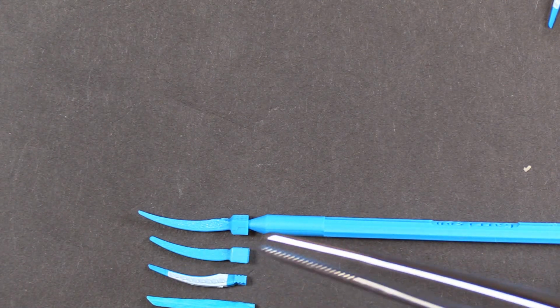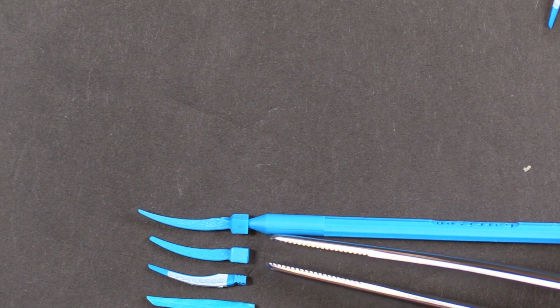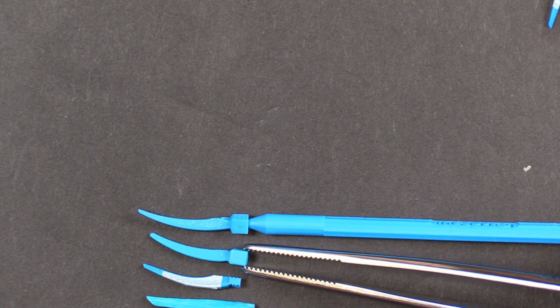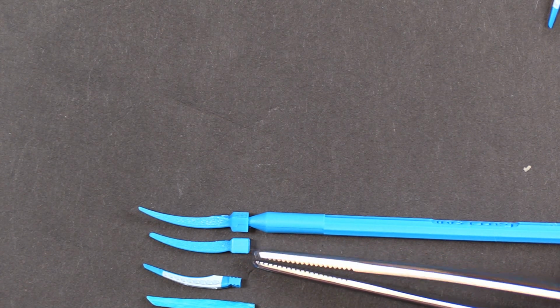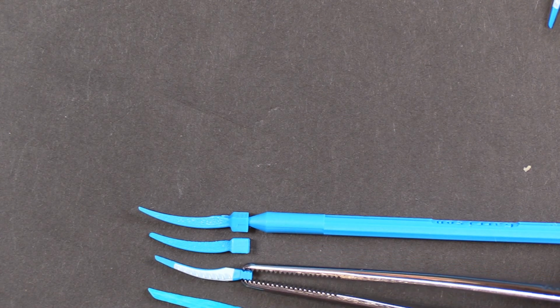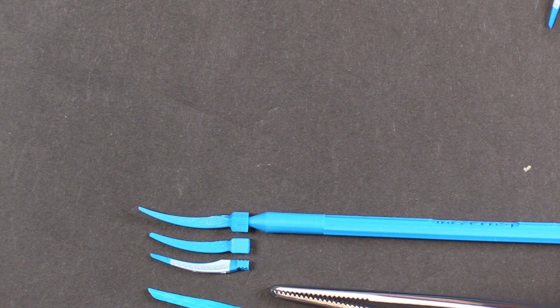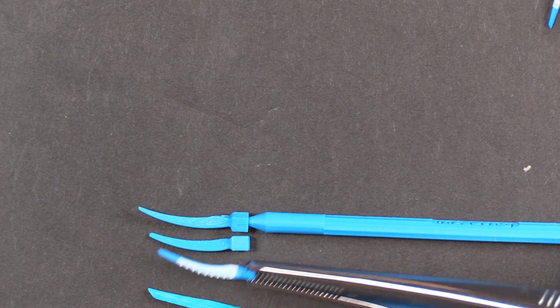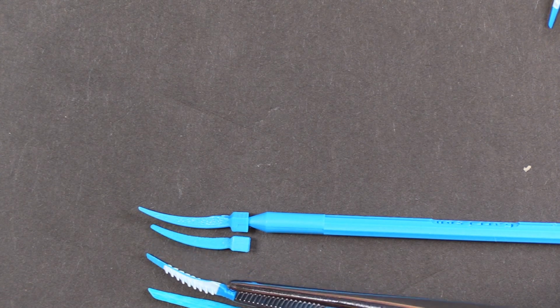You can see you've got a couple millimeters of extra length. I don't think you're going to find any wedges longer than that anywhere. In fact, we had enough people complain that when we came out with the G wedge a couple years later, we trimmed a couple millimeters off the length of it. The fusion wedges are essentially identical in size to the G wedge, but they've got the little rubber fingers on them to help with sealing and with back out.